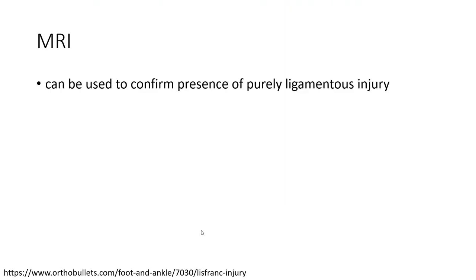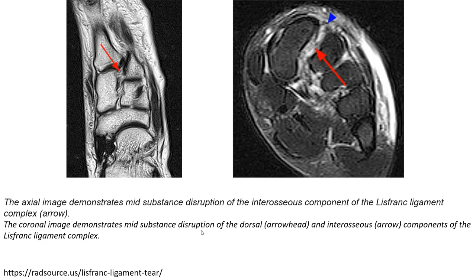MRI can be used to confirm the presence of a truly ligamentous injury. The axial MRI image demonstrates mid-substance disruption of the interosseous component of Lisfranc's ligament complex. Another axial image demonstrates mid-substance disruption of both the dorsal and interosseous components of Lisfranc's ligament complex.